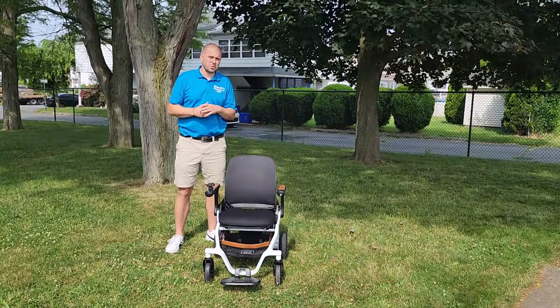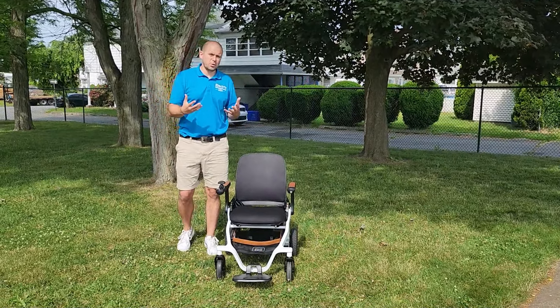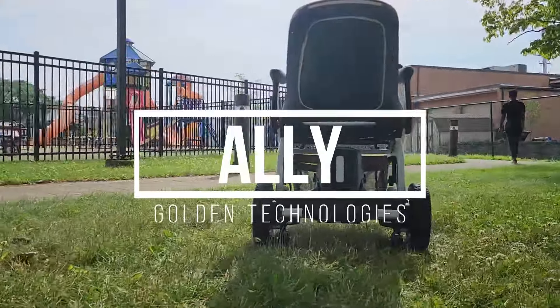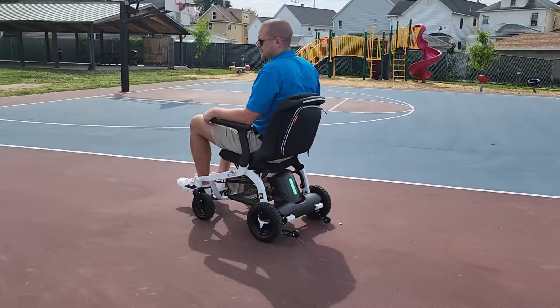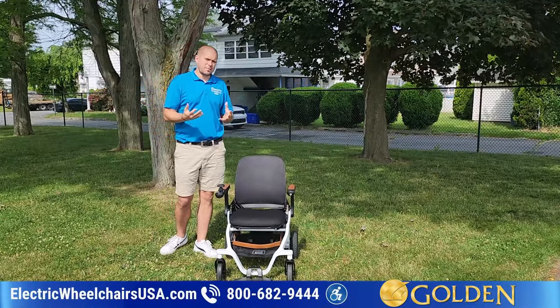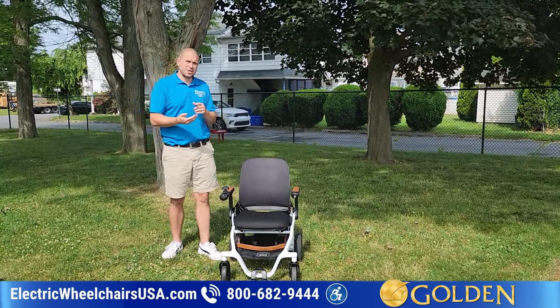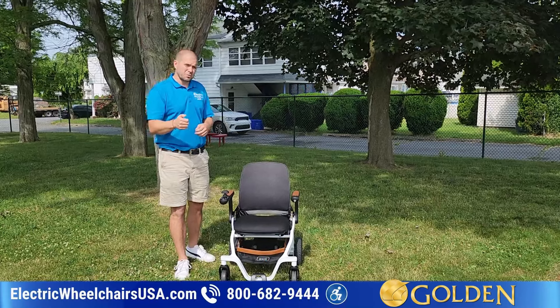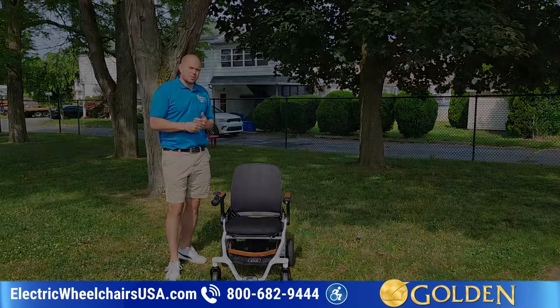Hi, welcome to the Electric Wheelchairs USA Mobility Experts channel. In this video, we're going to go over one of Golden Technology's newest products that they are distributing. It's called the Ally. This is a really unique, state-of-the-art folding power wheelchair that offers a 330-pound weight capacity, a battery range of around nine miles per charge. It is airline approved and has some really unique functions such as an attendant controller. You can download an app and control this chair through your phone, which is a really cool feature.